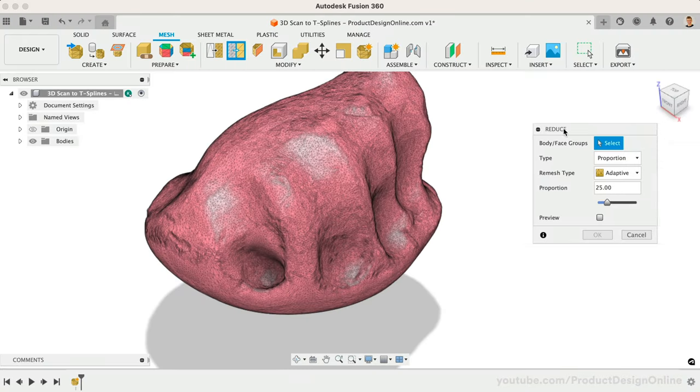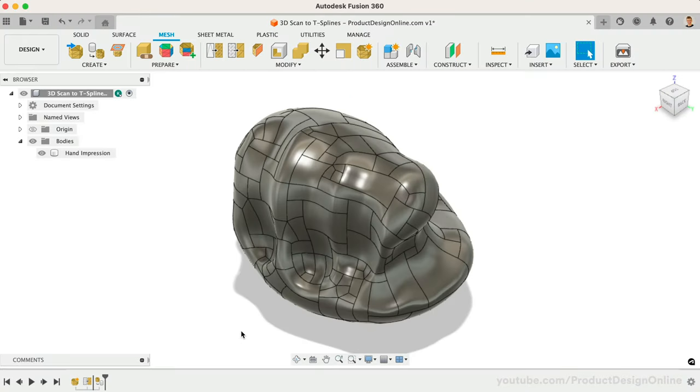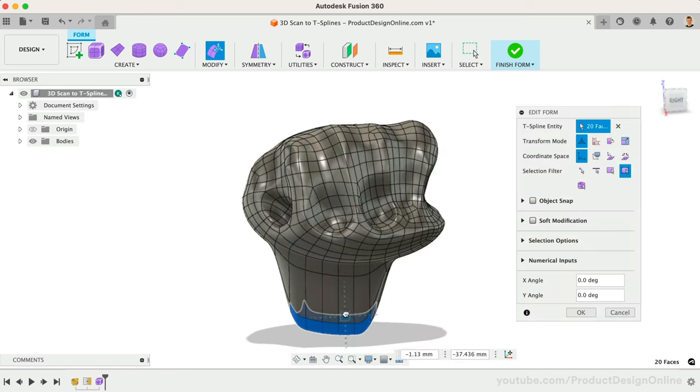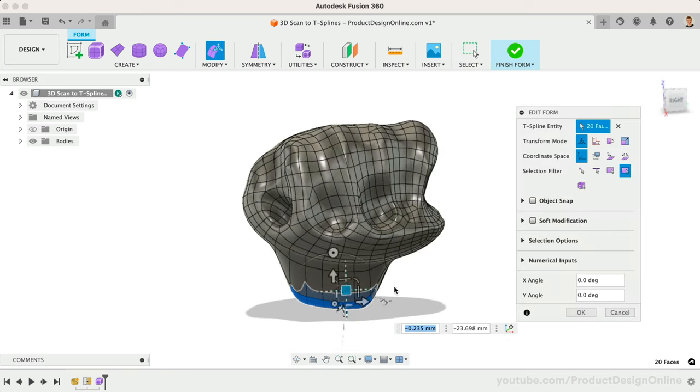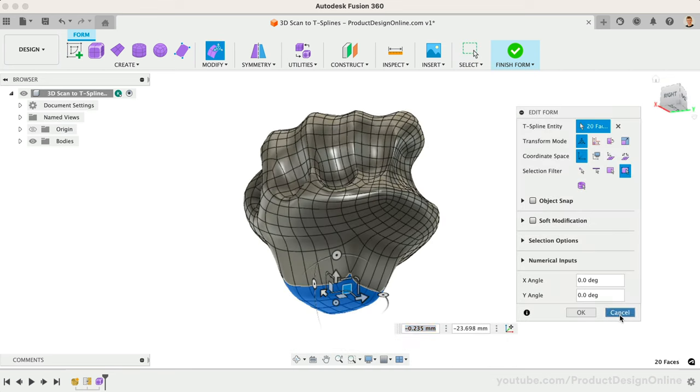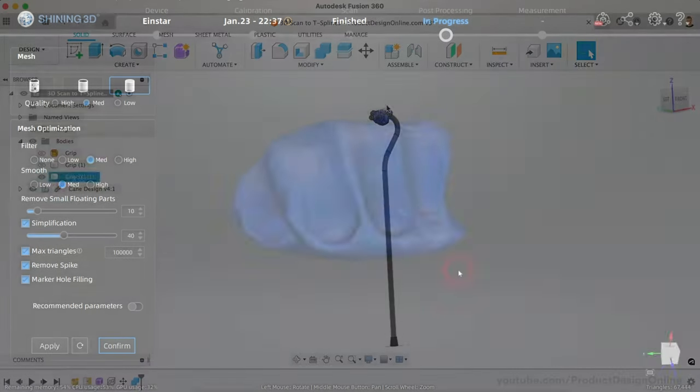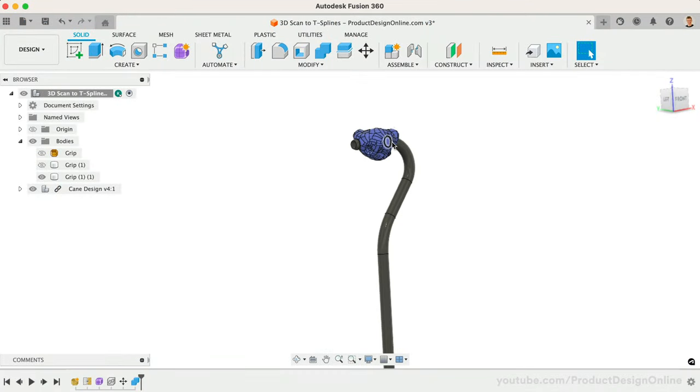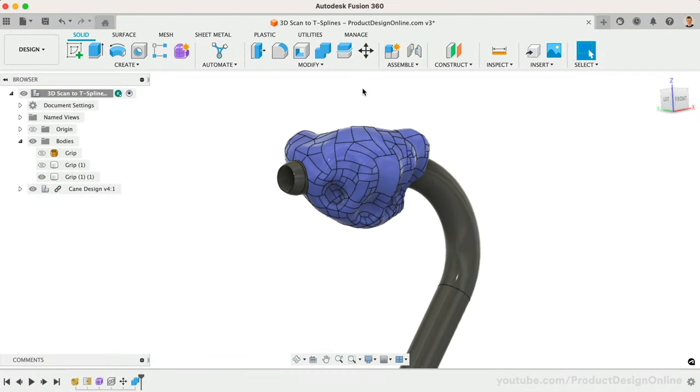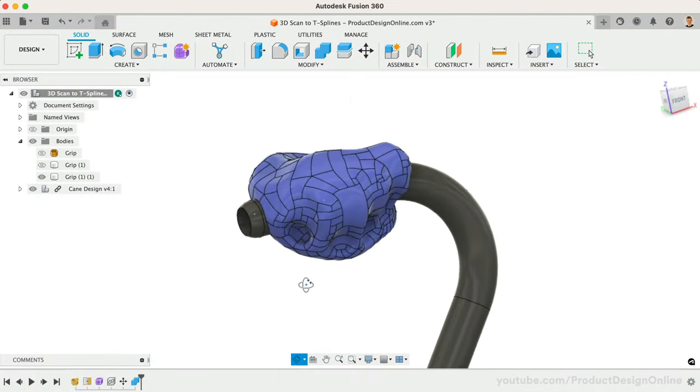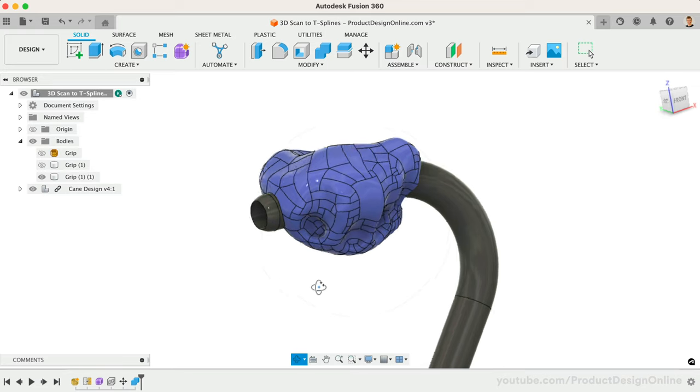Today, we'll look at turning an organic 3D scan into Fusion 360 T-Splines. This will allow us to scan the unique shape of modeling clay formed by a custom hand impression. We'll then use the 3D scan to create a custom grip for an assistive device, such as a cane.